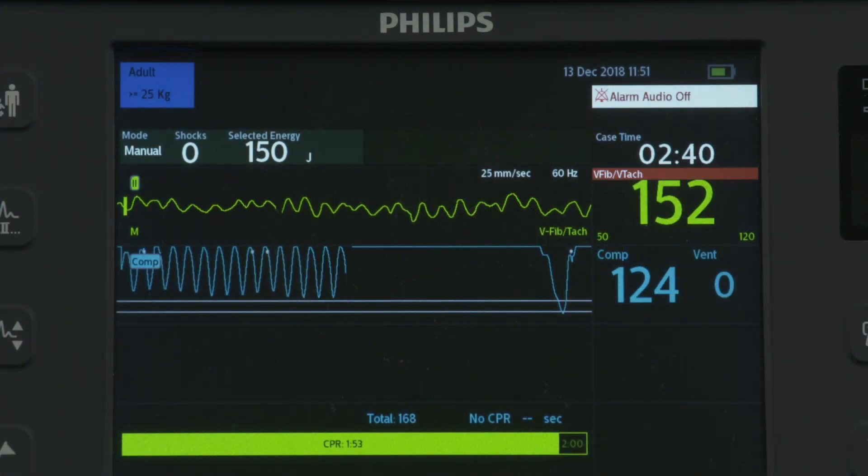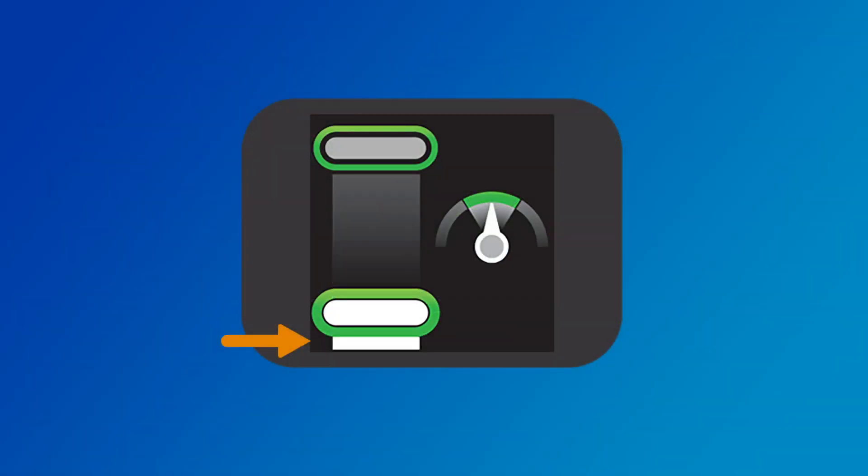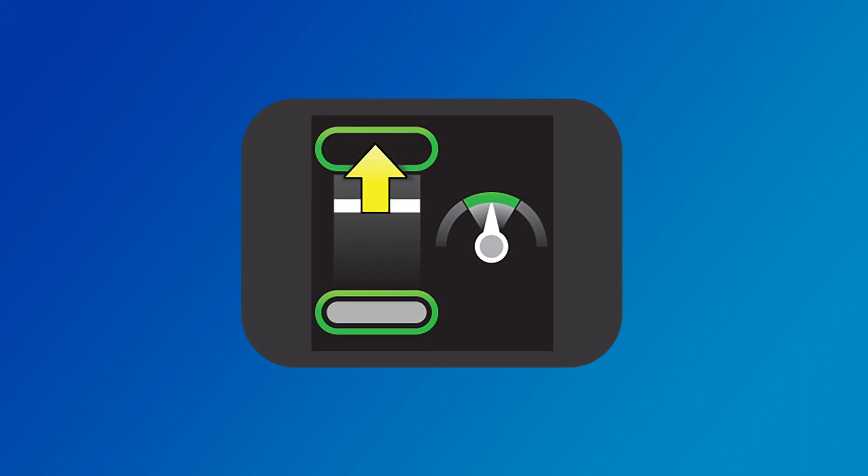If the compression depth is not corrected, the HeartStart Intrepid provides a corrective voice prompt: "Compress deeper." If the CPR meter detects a compression that reaches 70 millimeters, the area below the compression depth target area lights up. If you do not fully release pressure between four consecutive compressions, the CPR meter display shows a yellow arrow pointing up to the compression release target zone.